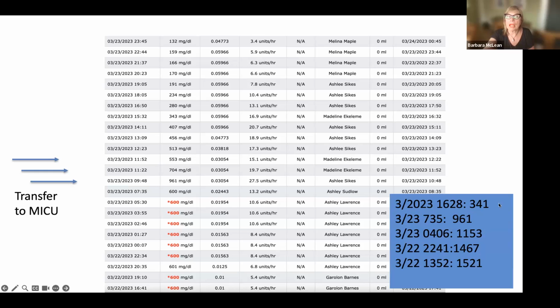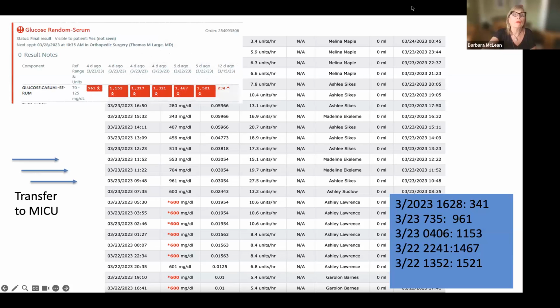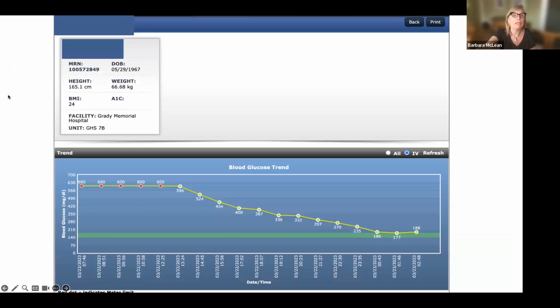So what I'm saying is, if you want to look at lab data to see how well your patient is doing, bravo. But do not put that data into the Glucommander, because you are going to actually trick your Glucommander. So again, this shows you the laboratory data and how it's dropping over time on this patient. Okay, so this was an excellent use of meter max. You can see meter max, that's in a red dot.